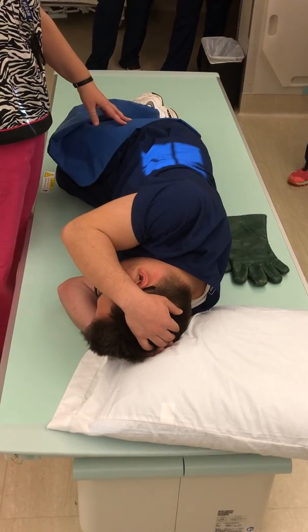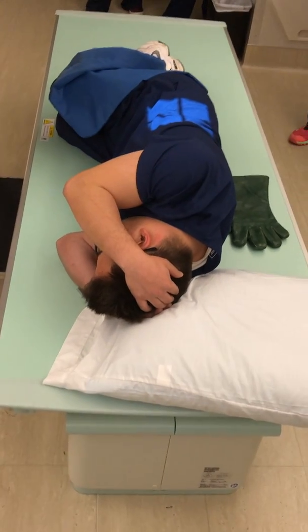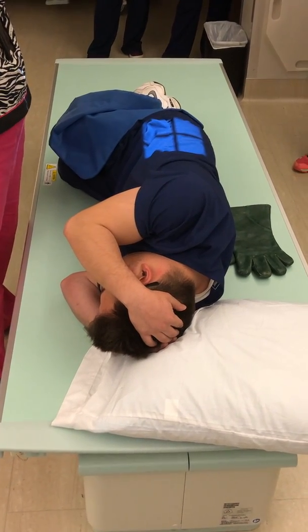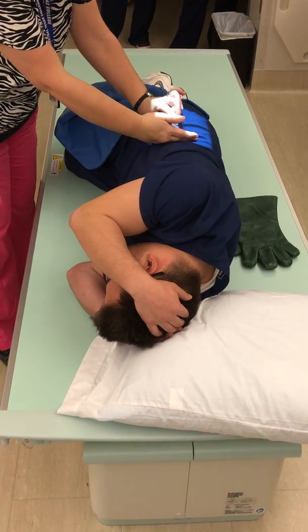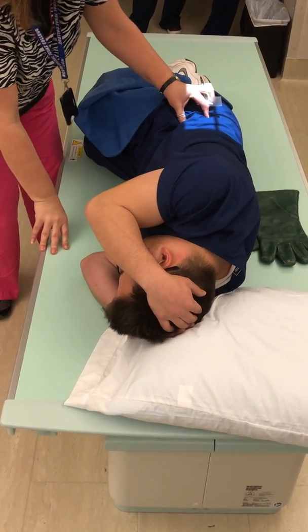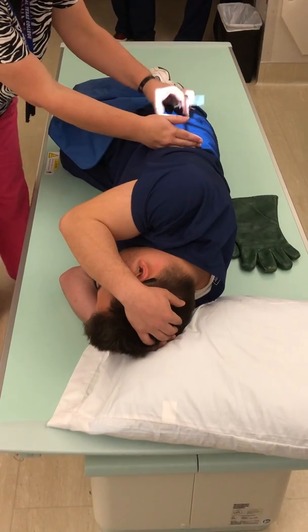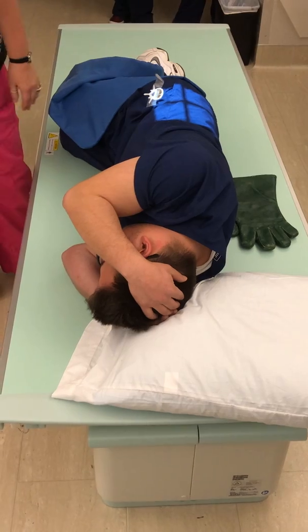Stay in the same position now. What I'm going to do is collimate down the new IR. Since he's a male patient, I'm going to angle 5 degrees caudally. The book tells us to go 2 inches posterior. Table's going to move. And 1.5 inches down from the top of the crest. So right about there. My marker placement is on the anterior, inferior corner.